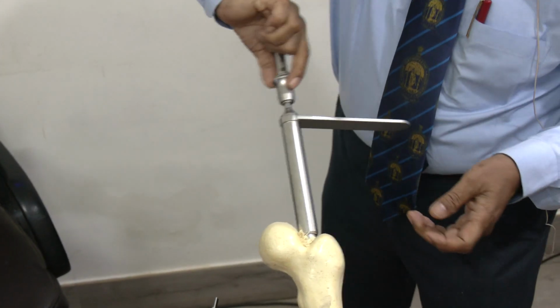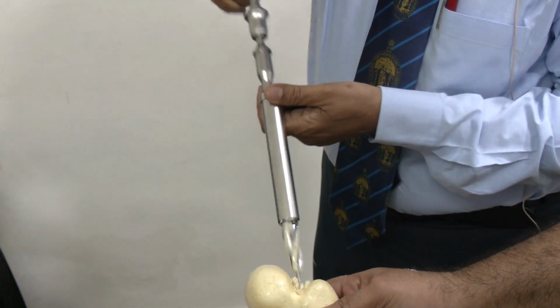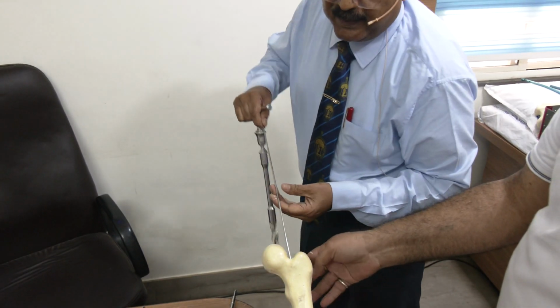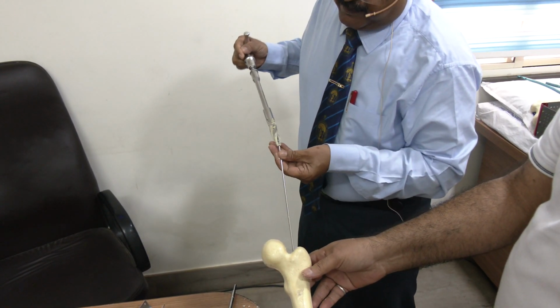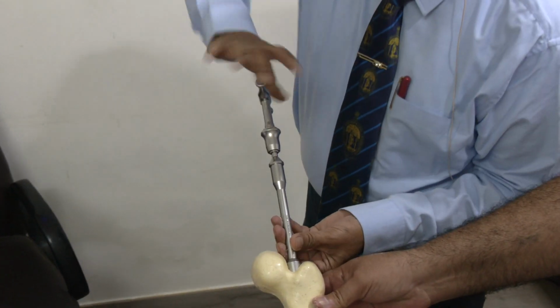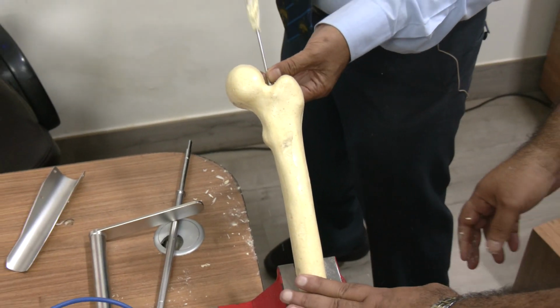That is the end. I cannot further push it down. So don't use the centering awl without the protector sleeve. Without this, if you use, you can push more inside, which is unnecessary. You will remove the bone from the proximal end of the femur. So that should never be done.